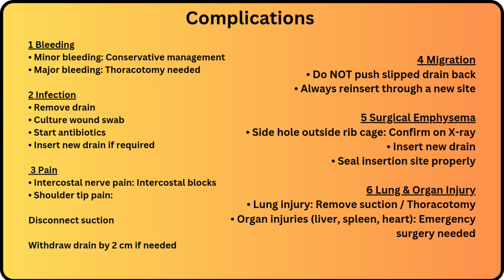Complications. Migration. Never push a slipped drain back in. Remove it completely and insert a new drain at a different site. Complications. Surgical emphysema. A chest X-ray will confirm surgical emphysema. Correct by inserting a new drain and sealing the insertion site.